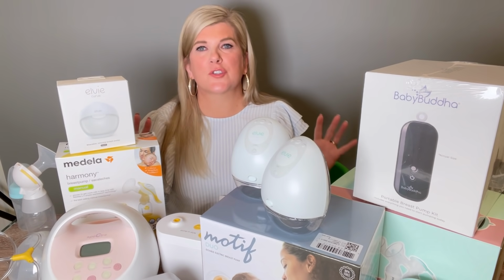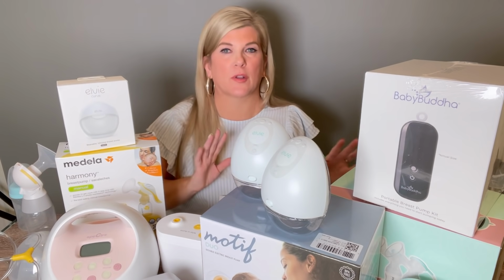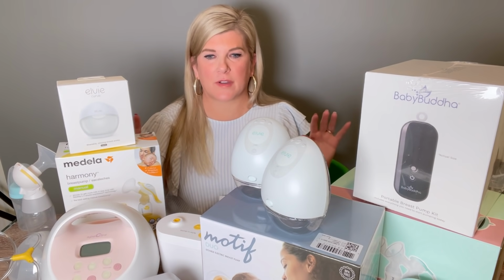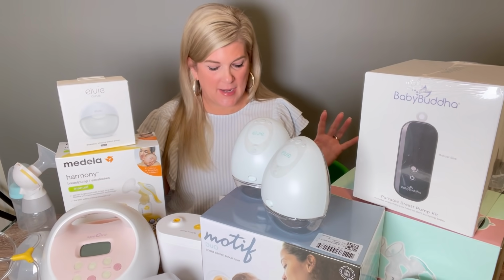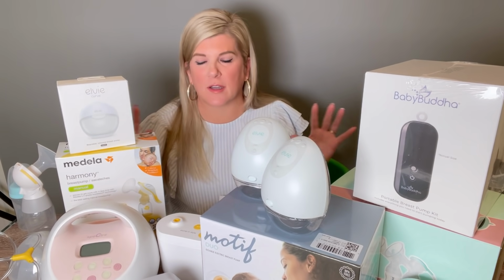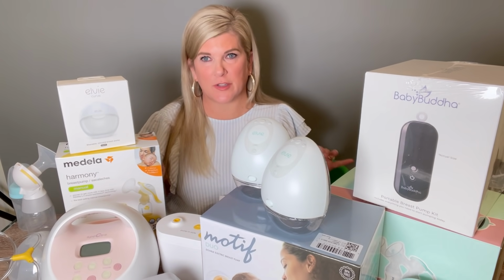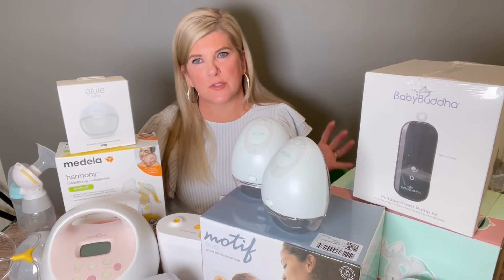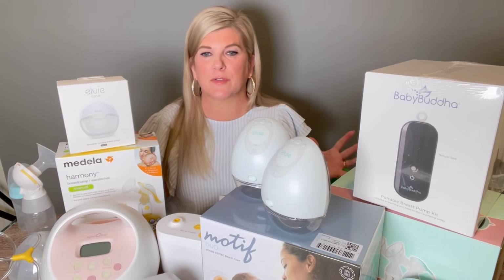They work and they're super, super useful, even to have in conjunction with your double electric breast pump. I would highly recommend having some sort of manual breast pump just on hand because they work in a number of ways. And they're good to start, or even just an emergency if you don't have your electric breast pump with you. And then towards the end of a pumping session, because they work a little bit differently, but they're very effective. But obviously it's labor intensive to sit there and use a manual breast pump for your entire pumping sessions, which usually take 15-20 minutes.